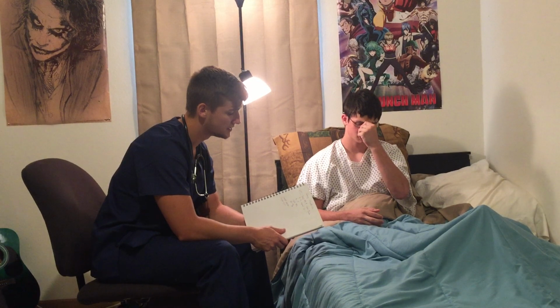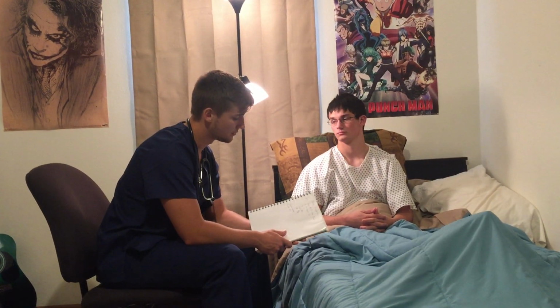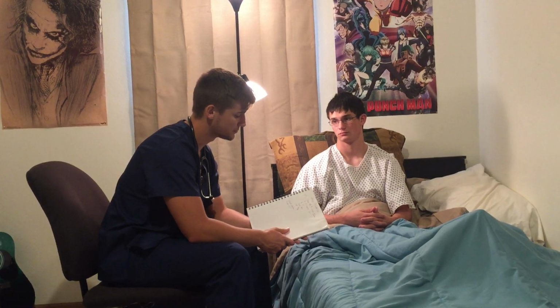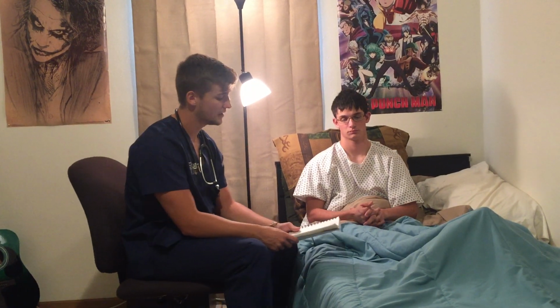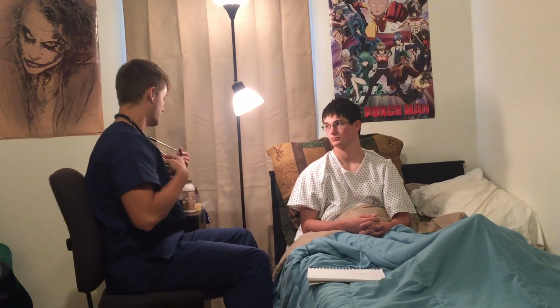Okay. His temperature is 98.9 through an oral route. His pulse is 74 with a regular rhythm with a strength of 2, respiration is 15, oxygen saturation 99, blood pressure is 134/84. His weight is 155 pounds and his height is 5'9". So we're going to begin your assessment.